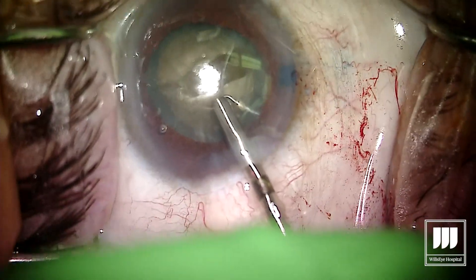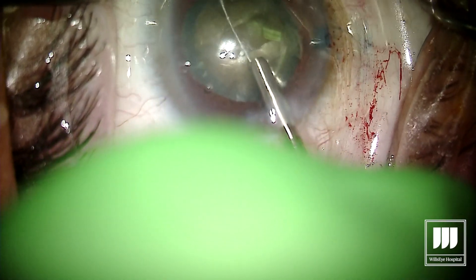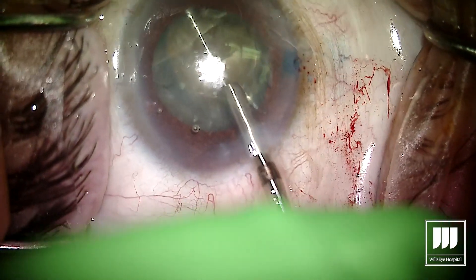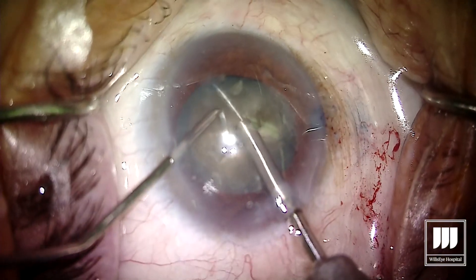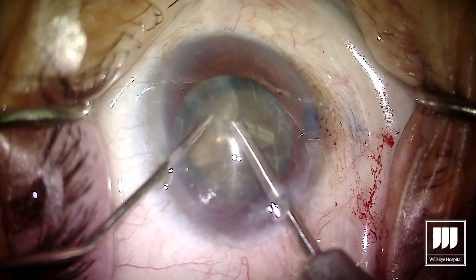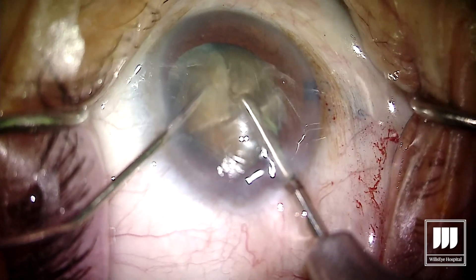Now we'll rotate the lens 90 degrees, extend the loop again, and once again rotate the loop to the left. Once I feel like it's pretty much in the middle of the lens, we'll constrict the loop and automatically have that lens subdivided into four pieces. Even in these mature lenses, once you can get the lens subdivided into smaller pieces, phaco emulsification can take over and you're not going to use nearly as much energy as when you're just in that eye forever trying to get the lens into pieces.